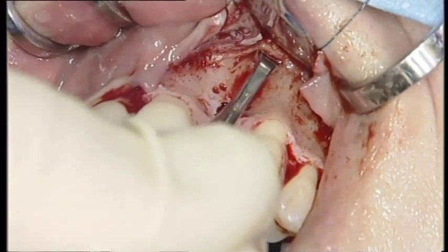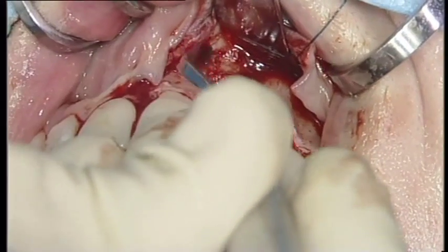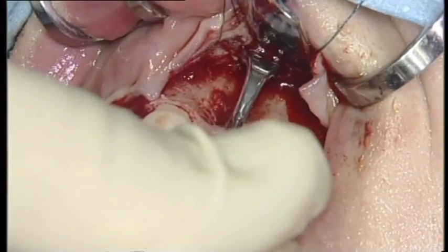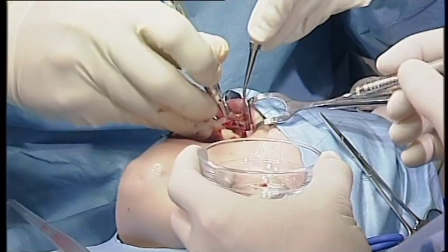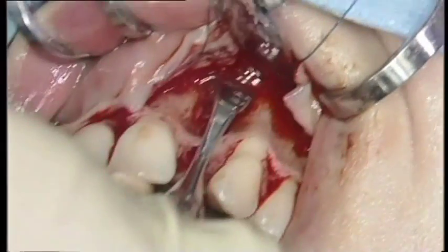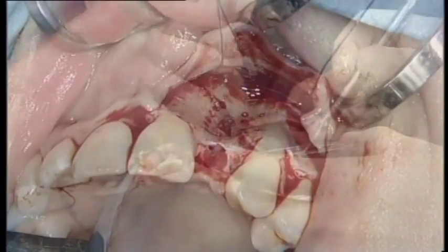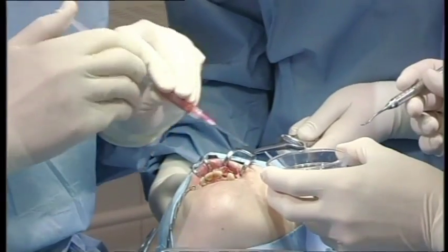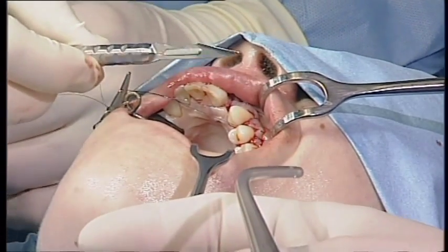Autogenous bone chips are collected with a Hu-Friedy bone scraper from the periapical area of the implant bed. The bone chips are set aside in a sterile glass dish. The same procedure is repeated to collect additional bone grafts. Blood is collected with a syringe and also kept in a sterile dish. A fresh number 11 blade is now selected to harvest connective tissue graft from the palate.